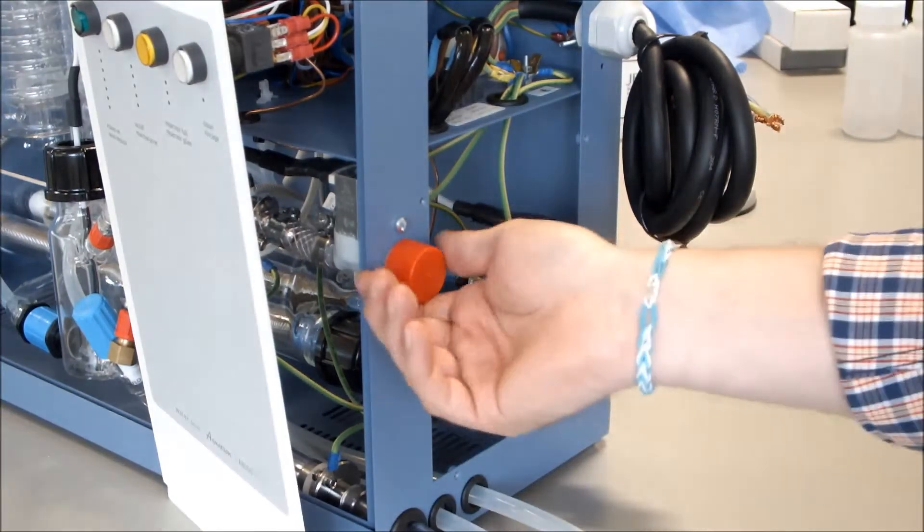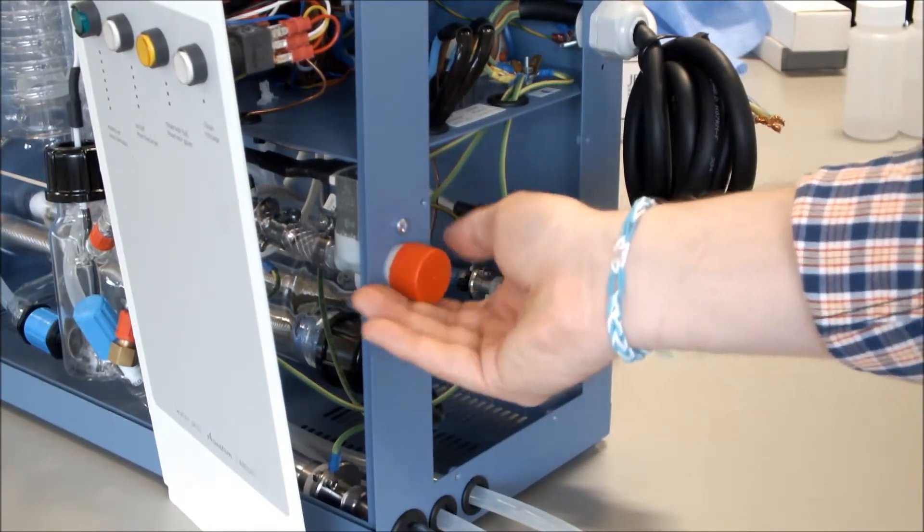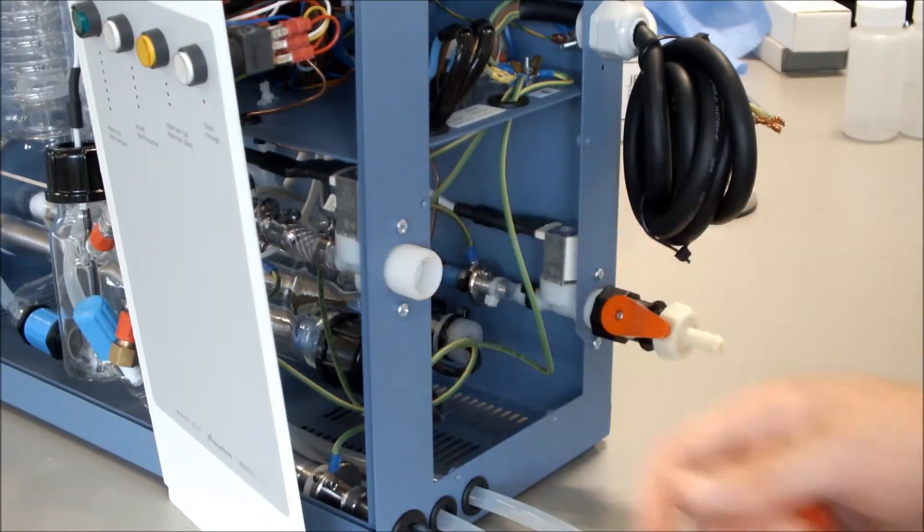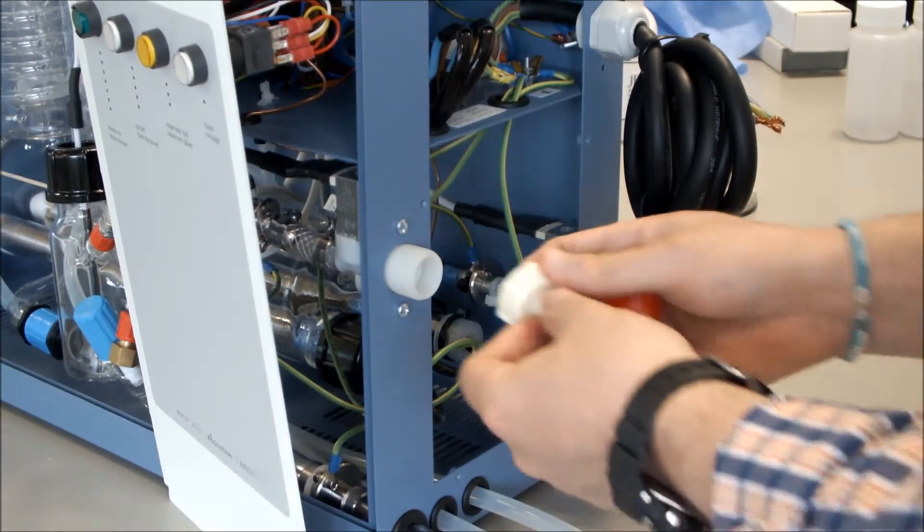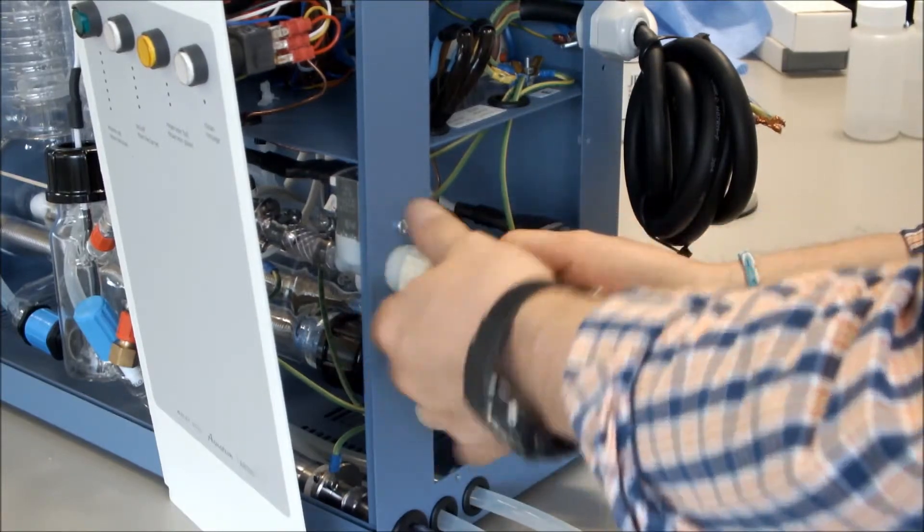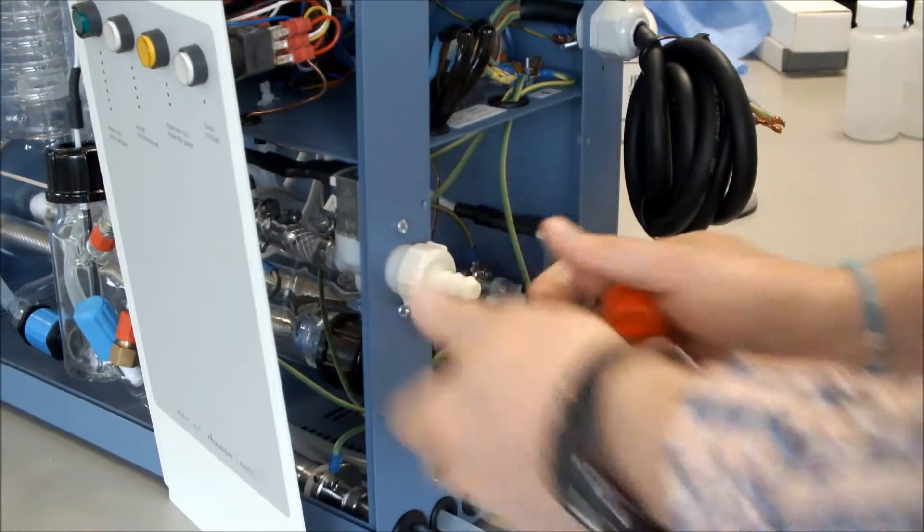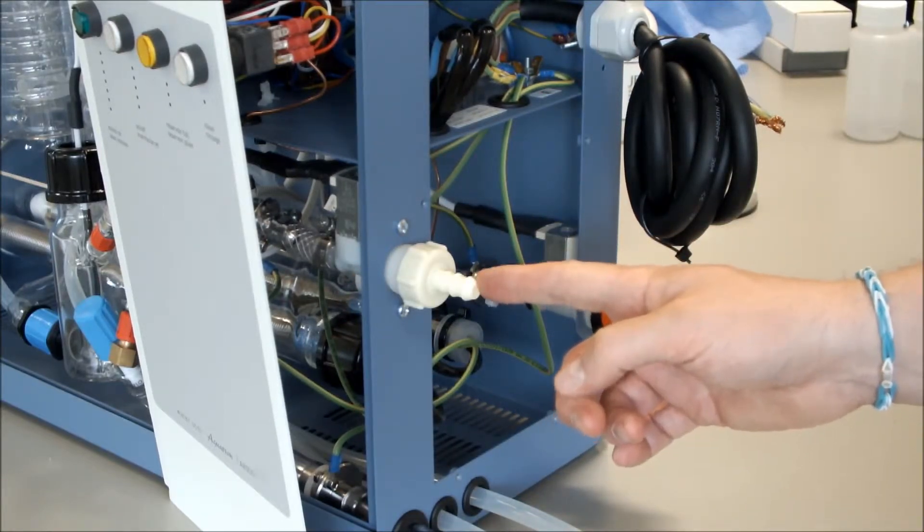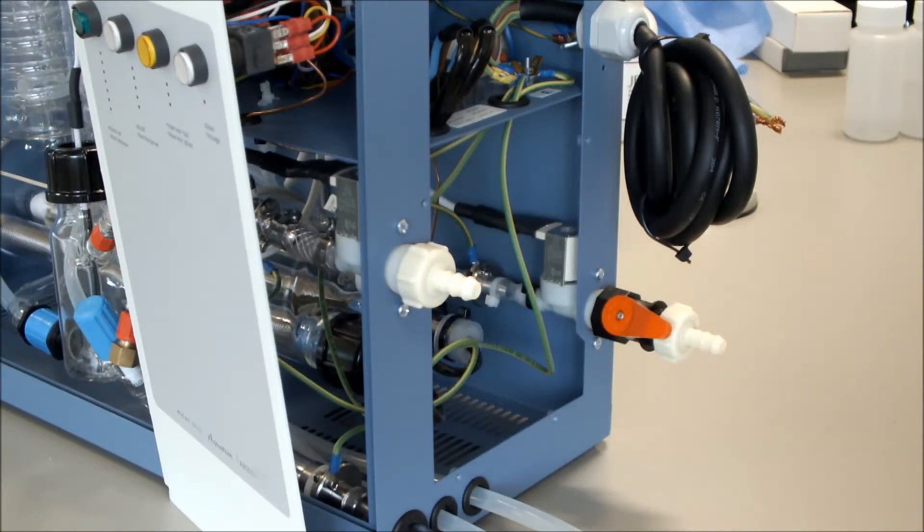We then remove our dummy cap from our deionised or pre-treated water inlet, and we can place our straight connector on there, like so. You can then connect to that with suitable tubing your deionised or pre-treated water.